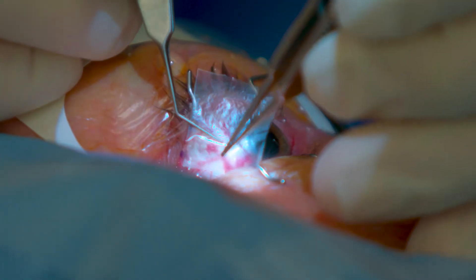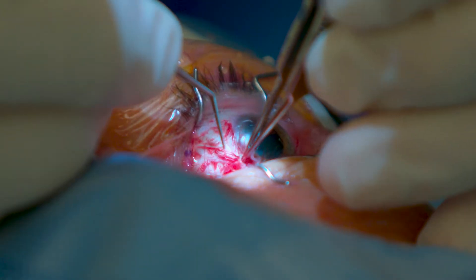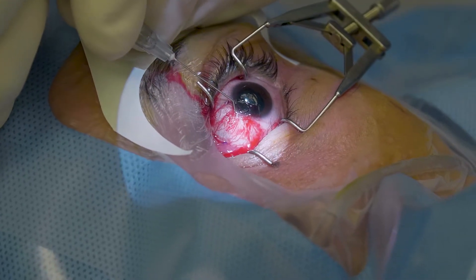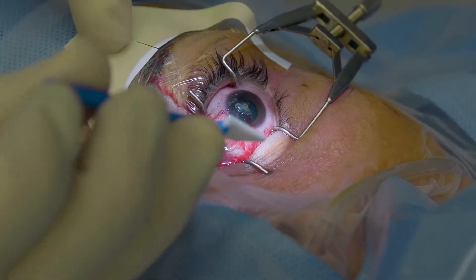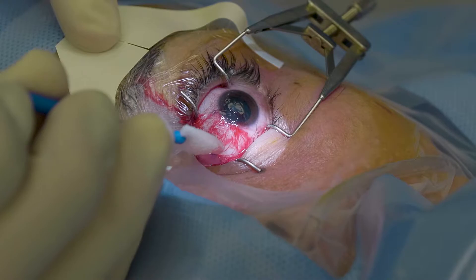Once the graft is placed, tucked in posteriorly and sized with respect to the anterior limbus, we utilize a combination of thick and thin glue — a fibrin-thrombin combination. Once it coagulates and congeals, we just smooth it out, typically using a Jameson muscle hook or a weck to remove excess glue, and that's what we utilize to secure the amniotic membrane.